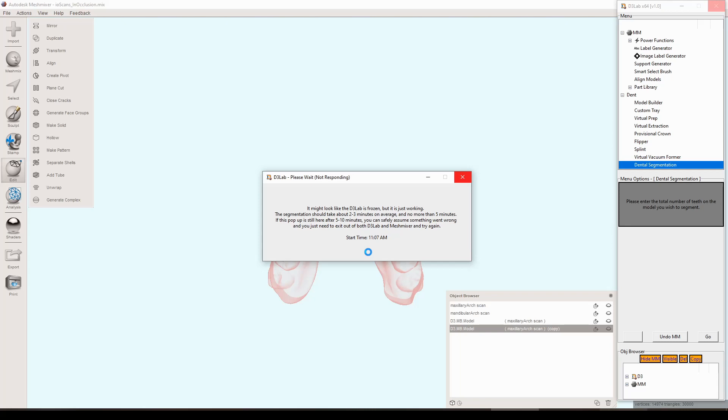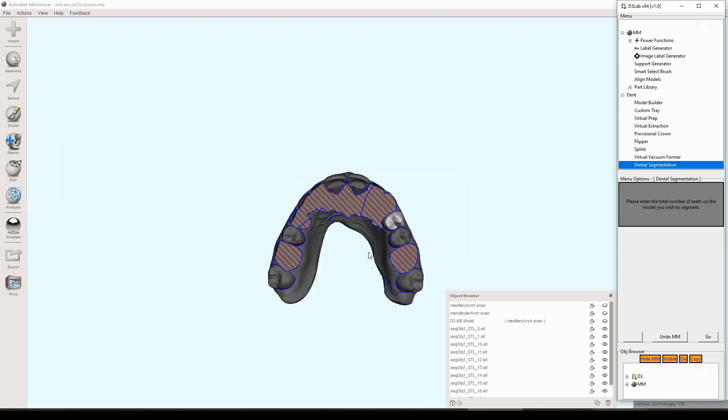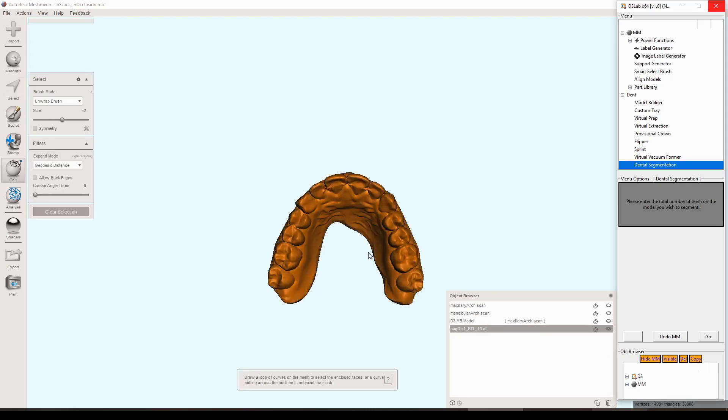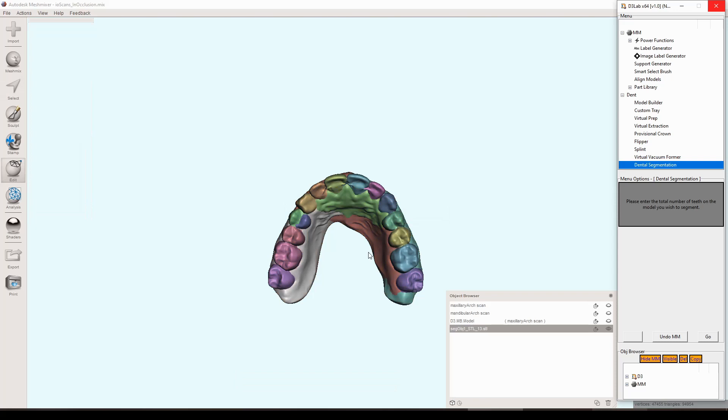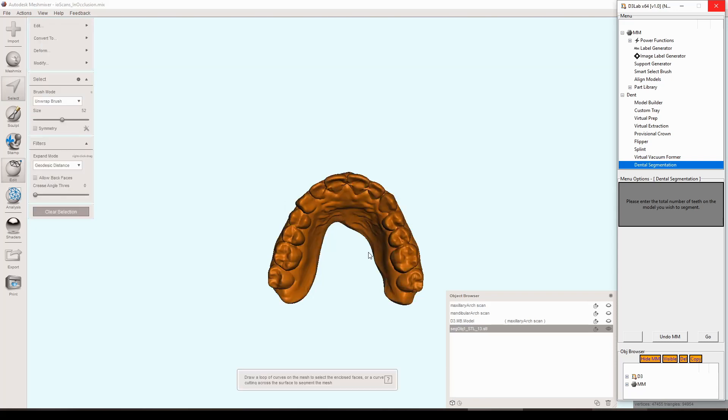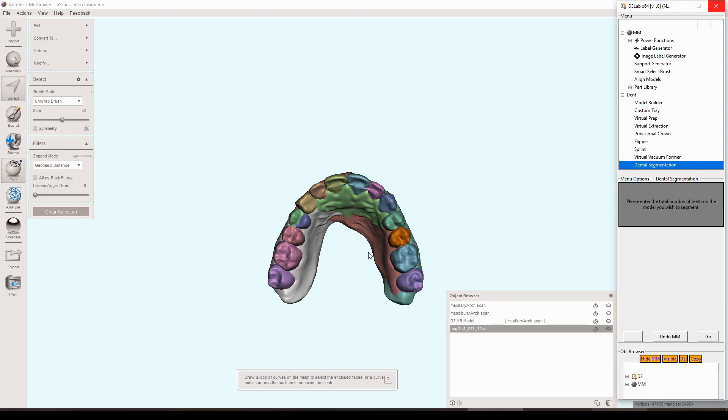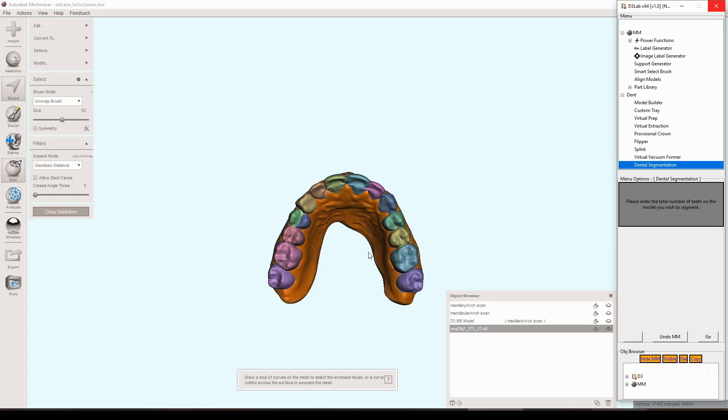I provide a little time stamp there so you can keep track of when this started in case you get up and come back. Looks like it's done and now it's importing all the different segments, combining them all, and then doing an upscale remesh. It took the triangle count and now it's remeshing it specifically with MeshMixer's Adaptive Remesh, which is a type of remeshing where it tries to maintain the accuracy of the geometry as much as possible while increasing the triangle count making it a little bit more dense. It's a good remesh to use for this particular application.